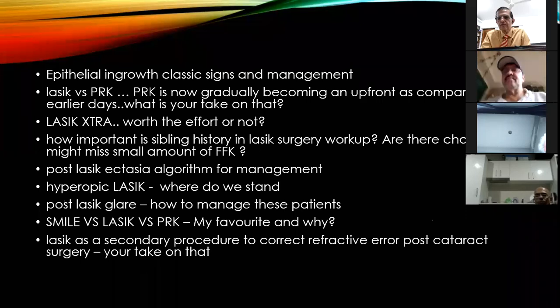Today, in my experience, PRK is almost as painless as LASIK. If you're following it up with contact lenses, I remove my contact lenses 5 days post-op or when the epithelium has formed over totally. And again, the rate of re-epithelialization is so variable. I've had epithelium reforming in 2 days, and I've removed the contact lens, giving it breathing space. I've removed the contact lens a day later. And I used mitomycin C.